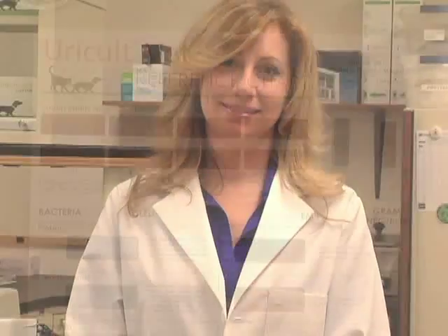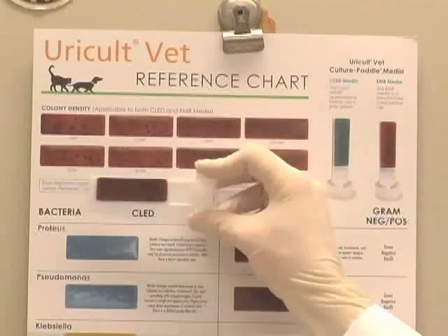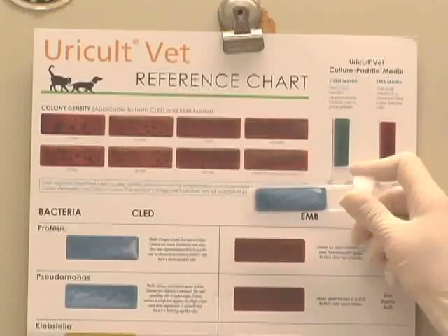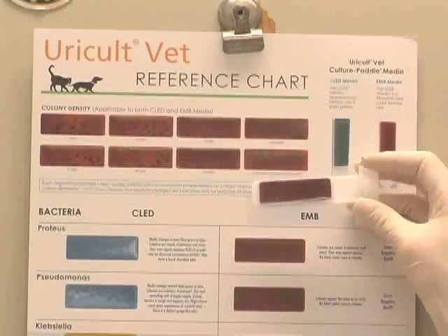If one or both sides of the media surfaces appear to have bacterial growth and the green side has turned toward blue or yellow, you can use the Uricult VET slide guide, technical manual, wall chart, or package insert to make an estimated colony count and preliminary identification. First, hold the paddle up to the colony density chart and match the number of colonies that appear on the media surfaces with the printed example it most closely resembles. Check both sides of the media but only report the highest colony count.